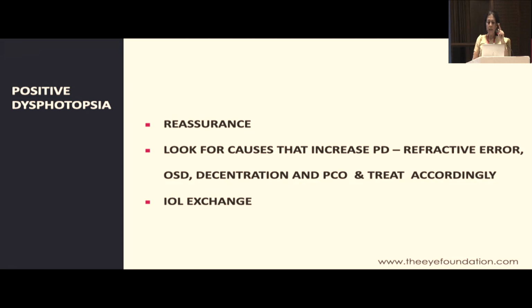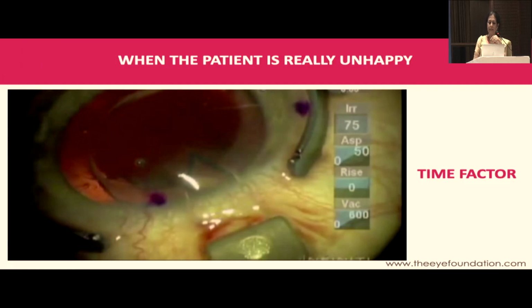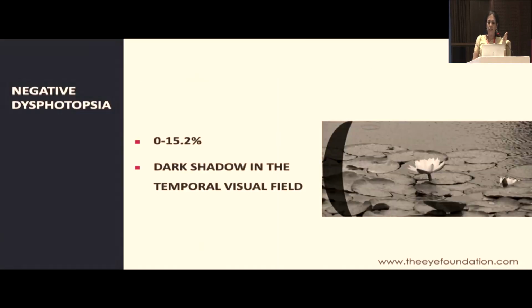But before that, you need to rule out that there is no ocular surface issue, there's no decentration, there's no PCO, because without knowing, don't jump to remove the intraocular lens. And I'm not going to show you the IOL exchange thing.